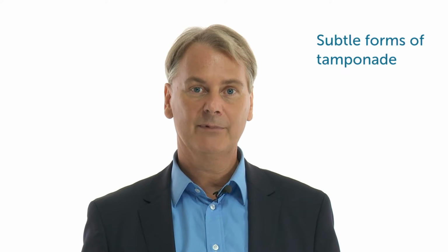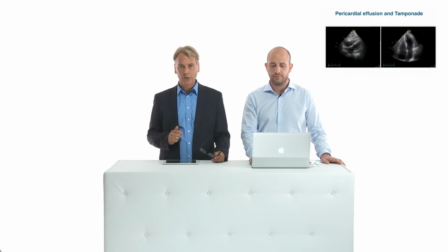Yes, but keep in mind that the word tamponade is actually reserved for those very acute situations where you have rapid fluid accumulation, which causes acute hemodynamic compromise of the heart. Sometimes it can happen much more slowly, or for example, a fluid can accumulate over weeks or days, and there you would not have this very acute situation. Those would be more subtle forms of tamponade. But here is such an acute form of tamponade.